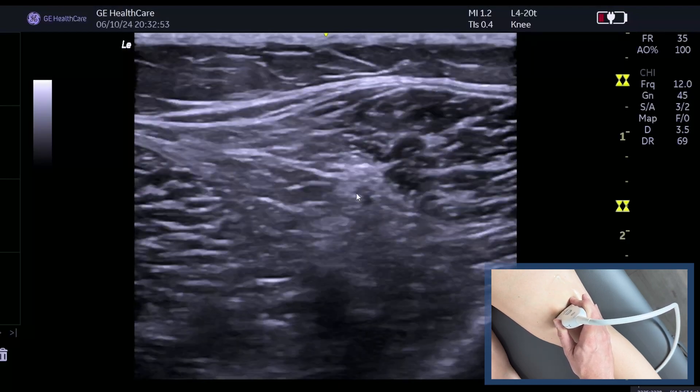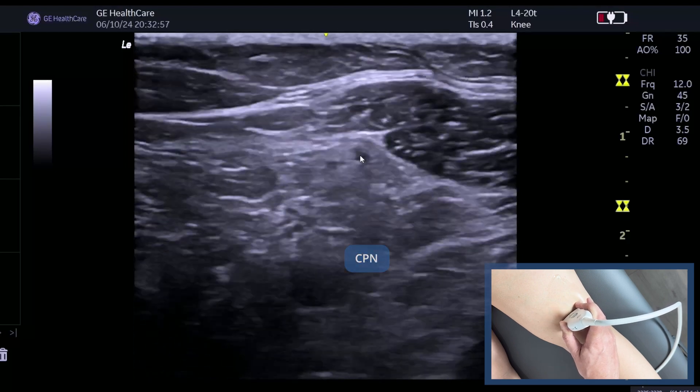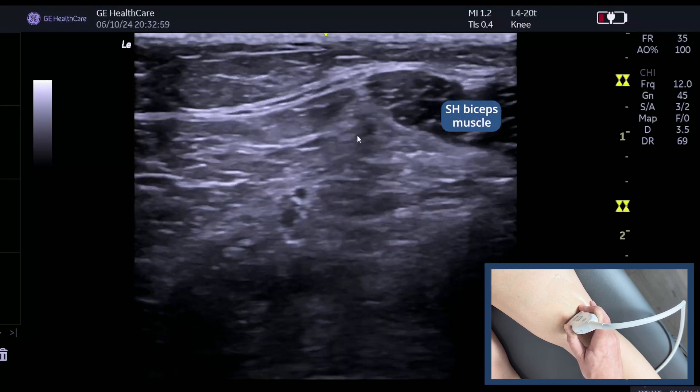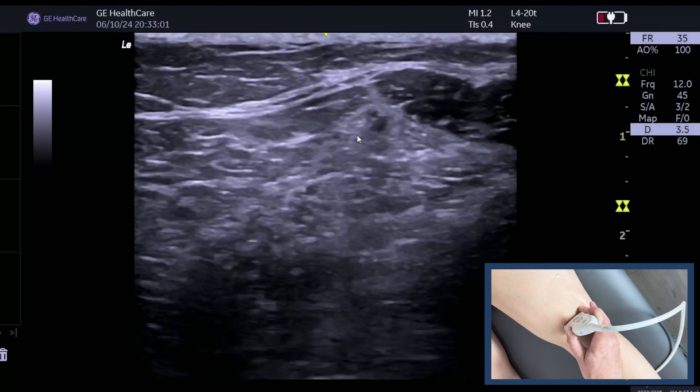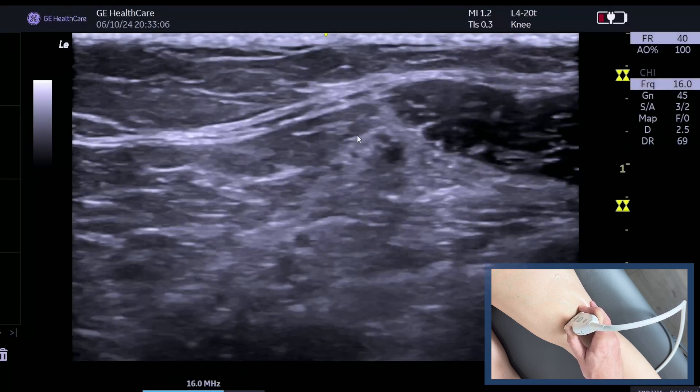Now let's follow that common peroneal. There it is — it sits just next door to the short head musculature. We can follow it up; we're just going to drop the depth to make it a bit more superficial, and we can also increase our frequency now.